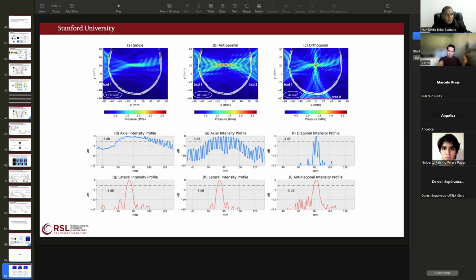What we do is that we put them inside the MR scanner. We give them this helmet transducer. It has 1,024 transducer elements. We do all of these things that I talked about, the phase aberration correction and all of that, and we make sure all the 1,024 rays intersect at this specific part of the thalamus. At first we send very low intensity pulses, and we record the image using MR thermometry. The rise in temperature is something like 0.2 or 0.4 degrees Celsius, and that is enough for MR to be able to pick out where the target is.